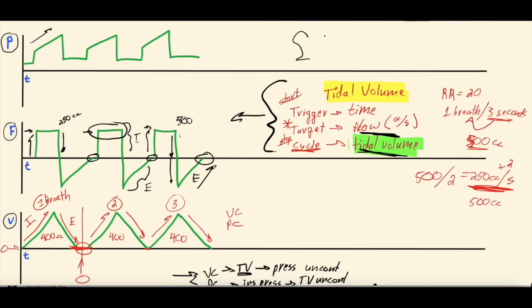Right? You've got 2 lungs here. You've got a trachea that goes into these lungs, and I'm pushing air in, and that air has to expand the lungs. But the lungs have a compliance, right? It takes effort to expand those lungs and overcome the lungs' compliance, but that in turn creates pressure pushing back, because those lungs are expanding and kind of pushing back as they expand. And that's what causes the pressure that is created.